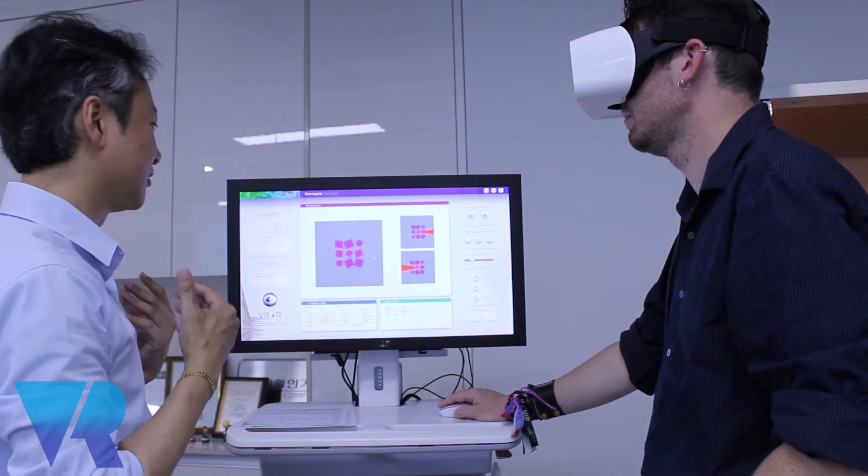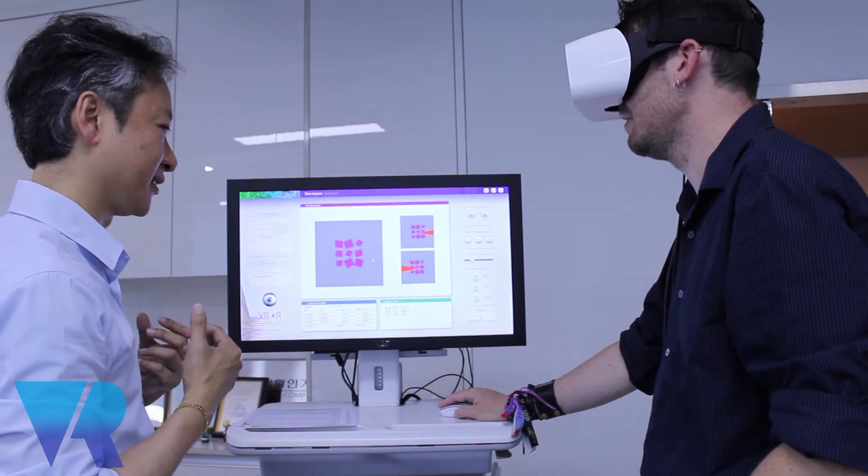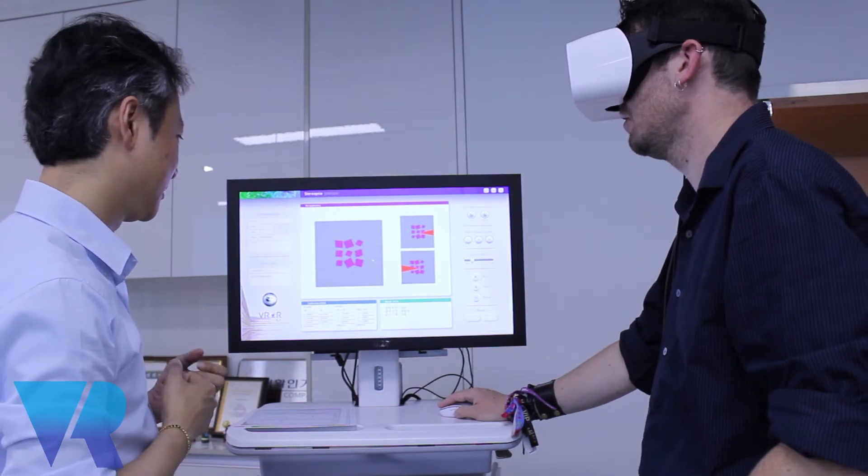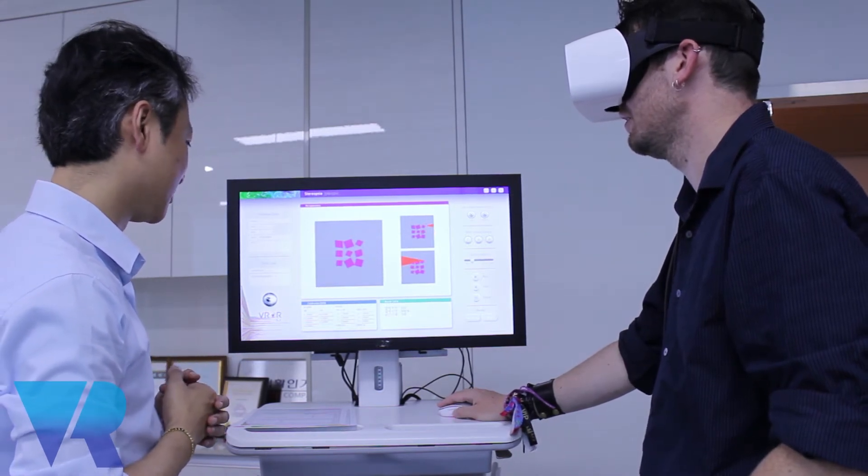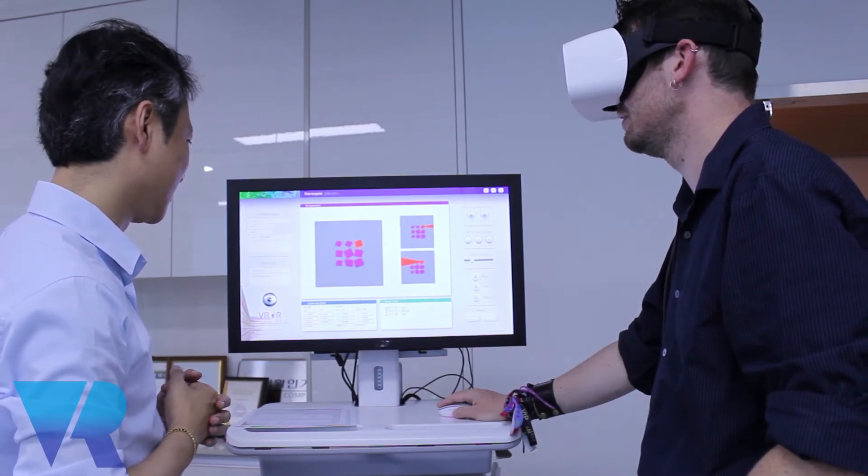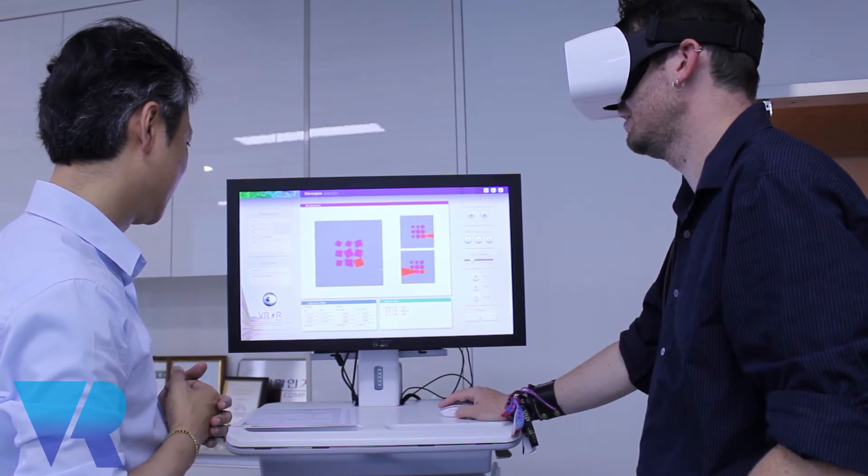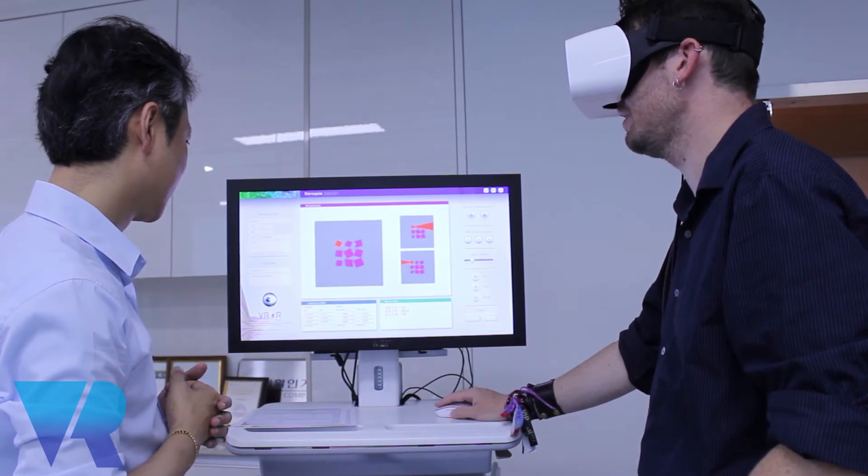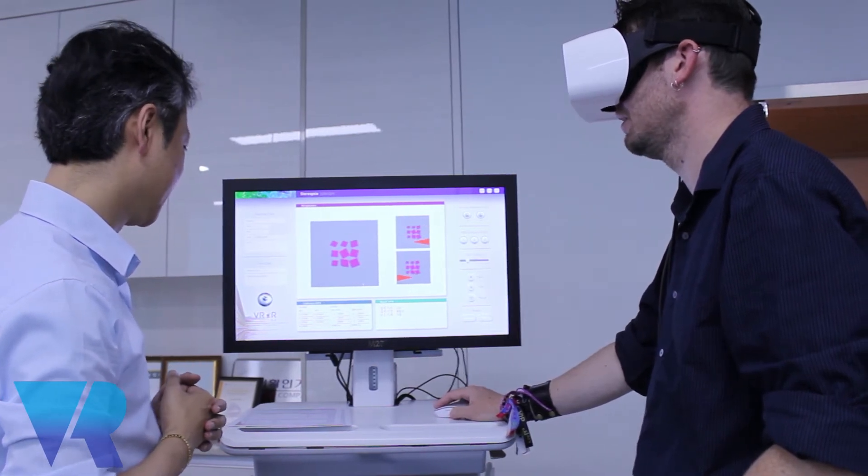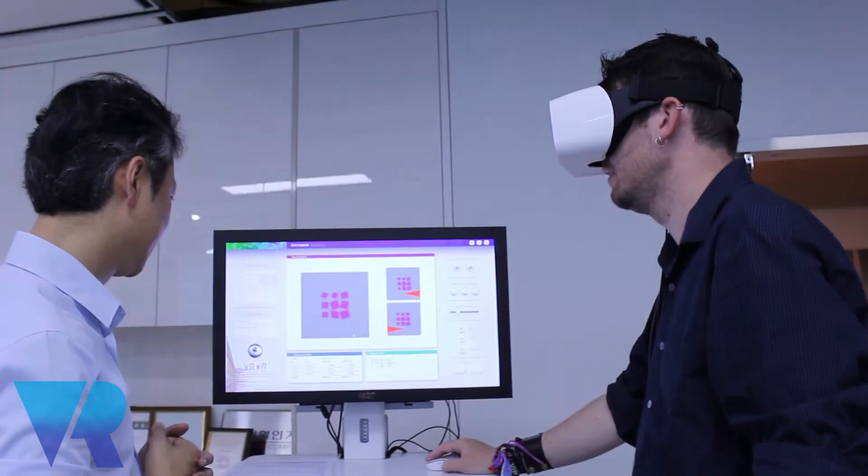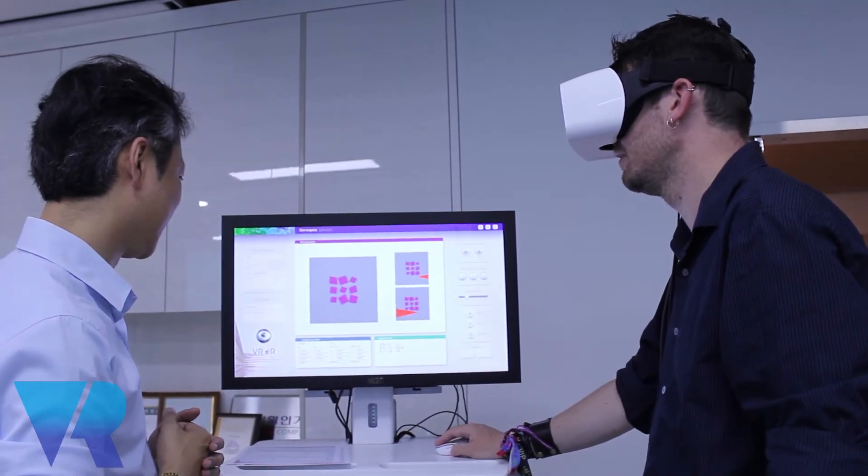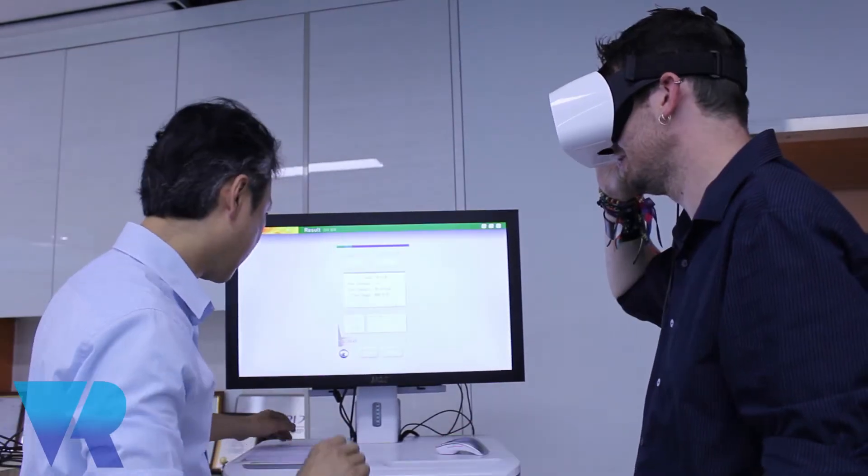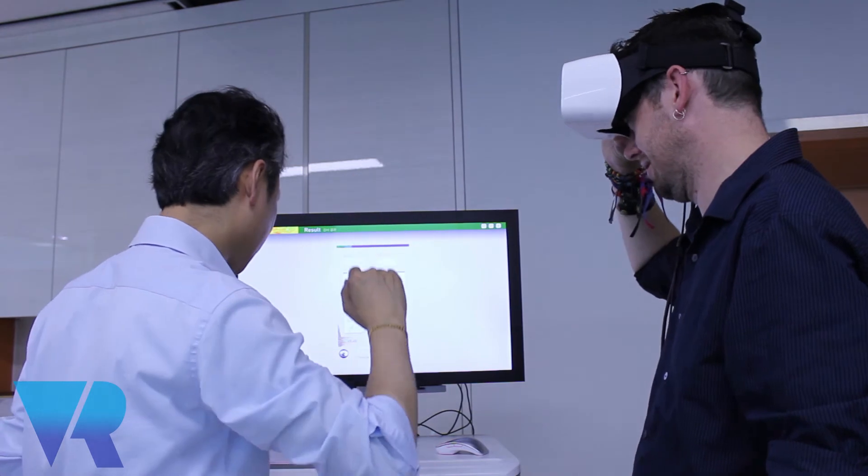Which one is nearest object? Oh, nearest to me? Yes. Oh God, it's really hard. That one. Is it always nearest? Yeah, always nearest. This is really tricky. Yeah, it is. I think it's... No, you can take it off.